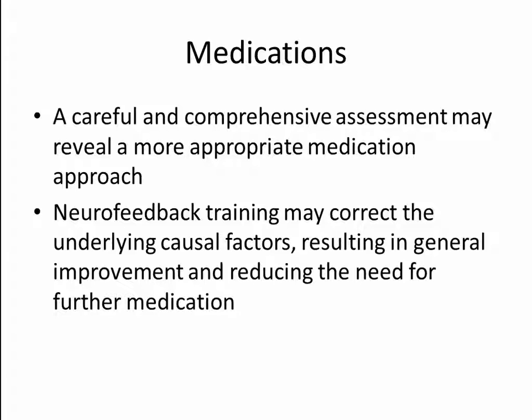Quite often I can look at an EEG assessment where the child has been diagnosed with ADHD and prescribed a stimulant medication, and I can suggest that because of the characteristics of the EEG that I'm seeing, a stimulant medication may not be the optimal medication for this child, and I'll put that in my report to the physician, but I won't suggest that to the client because I don't want to be in the position of telling the client what to do about their medications.